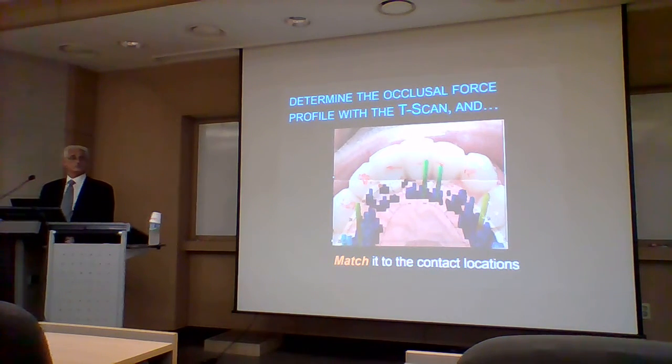왜 교합을 어렵게 생각하는지에 대한 이해인데, 교합은 결국 포스에 따라서 달라질 텐데 포스를 측정할 방법이 없었기 때문에 내가 이렇게 치료를 했는데 결과는 내가 예측한 대로 안 나오는 거야. 그게 당연히 그렇게 될 수밖에 없었던 것이, 티스캔 없이 프레셔를 인디케이팅 할 수 있는 디바이스 없이 교합을 조정한다고 하는 것들이 교합 이론을 적용하는 데 있어서 한계점들이 있을 수밖에 없다는 거죠.